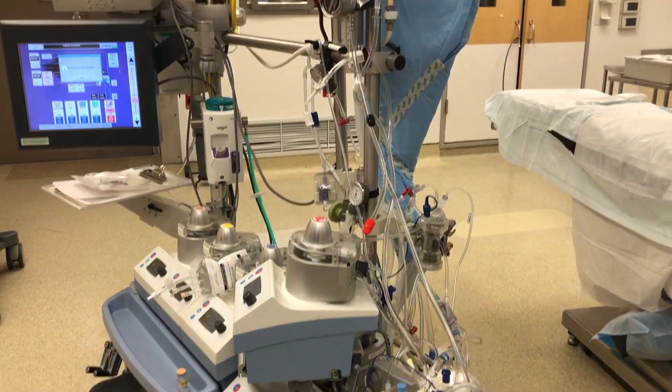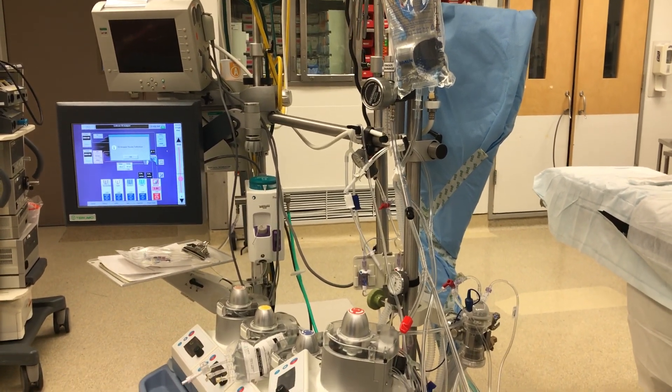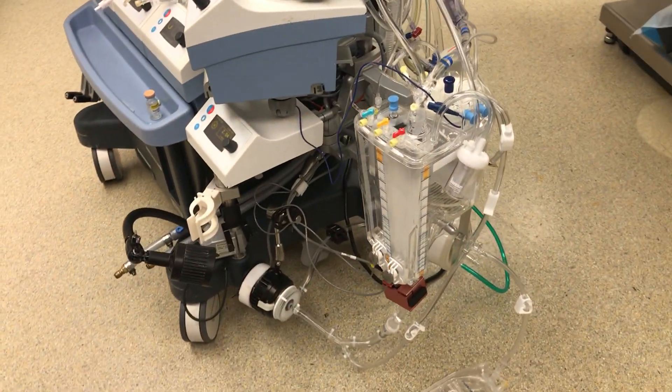Welcome to the section on Perfusion. Perfusion is the heart-lung machine, basically, and what we're going to do is take the bad blood out and put the good blood back in.